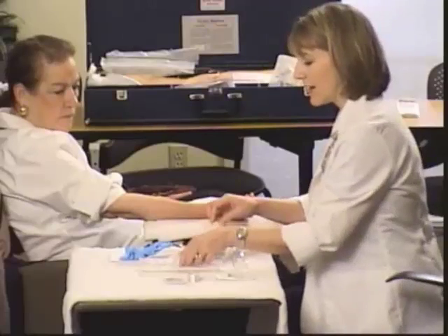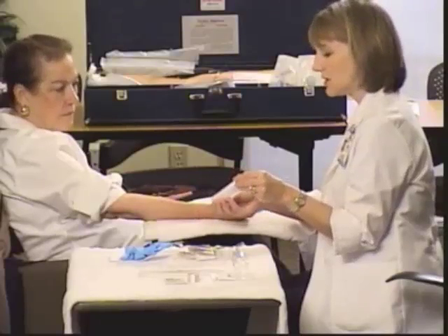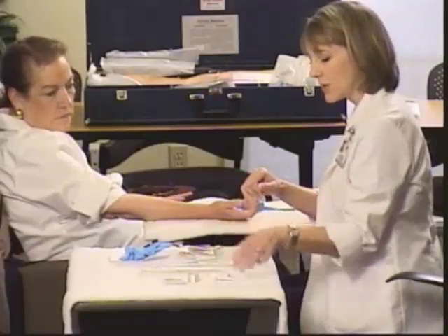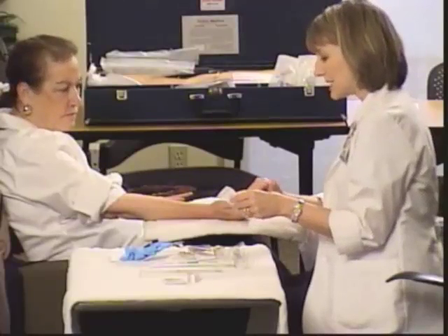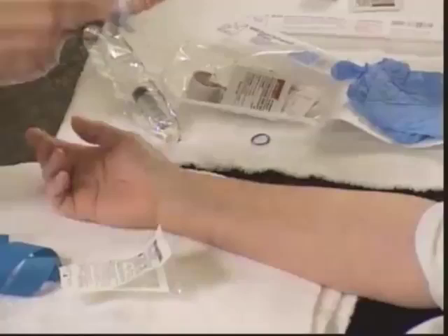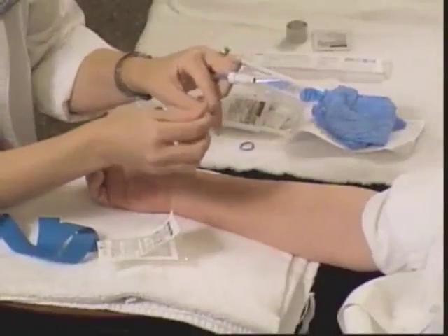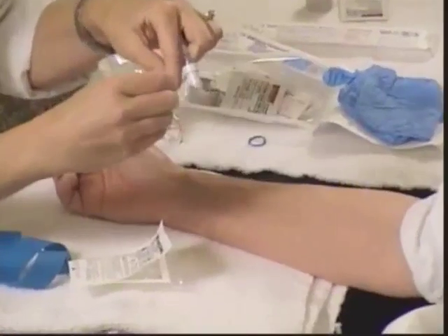I've chosen a 22 gauge because for fluid maintenance this should work well. The packaging will tell you both the gauge and the length — this is a one-inch needle catheter. For a saline lock, we're going to need this small bore extension set. Everything in the package is sterile, so as long as you don't contaminate it, you can connect directly to the luer lock end. Don't touch the end of this cap either, because it connects directly to the IV hub.